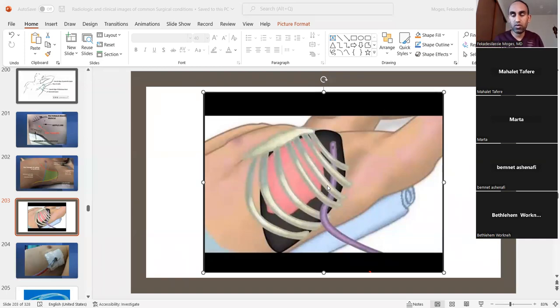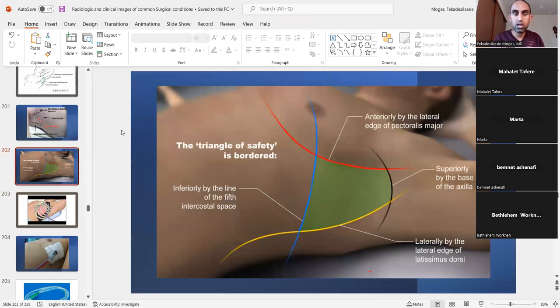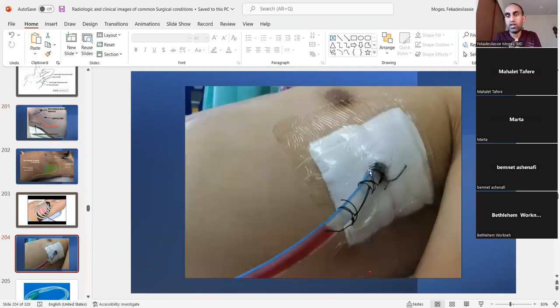That has happened. We have seen complications after chest tube insertion. So the triangle of safety, people talk about it a lot, because if you introduce it here, you avoid those potential complications. So this is a chest tube in action.